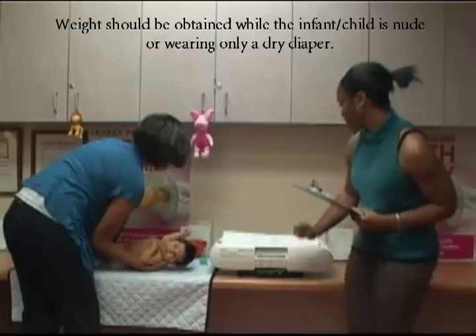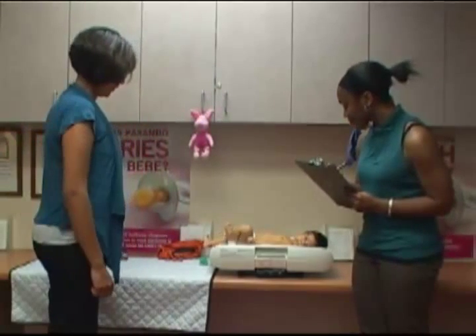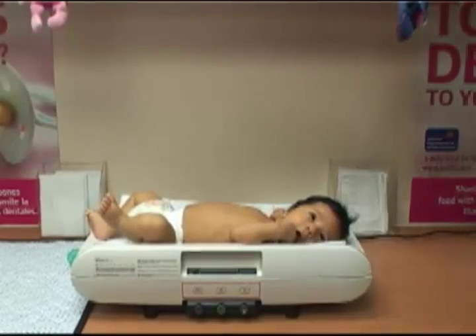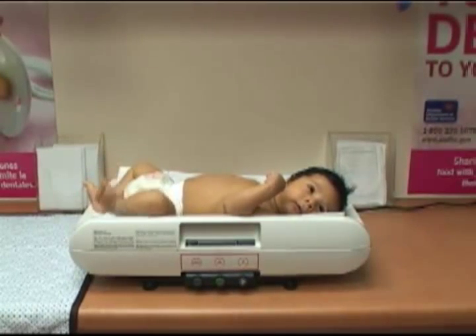Have the caregiver gently place the child onto the center of the scale. Younger infants should be measured lying down, but you might consider weighing older infants sitting up so they can fit comfortably in the center of the scale. Try to make sure the child isn't hanging on to the caregiver or being held or touched, because that could throw the weight off. Also, it's best if the child doesn't touch the sides of the scale and all of the child's body must be within the scale's tray.